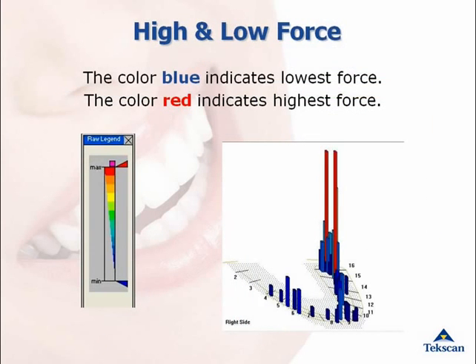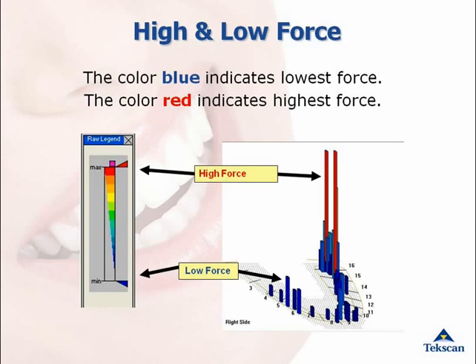The T-Scan system measures relative force. The software provides a force legend that shows the different force levels that can be graphically displayed by color coding from lowest forces, blue, through middle forces, green and yellow, up to the highest forces, red and orange. The force legend illustrates the color coding, which describes 256 levels of force that can be recorded in a given movie.